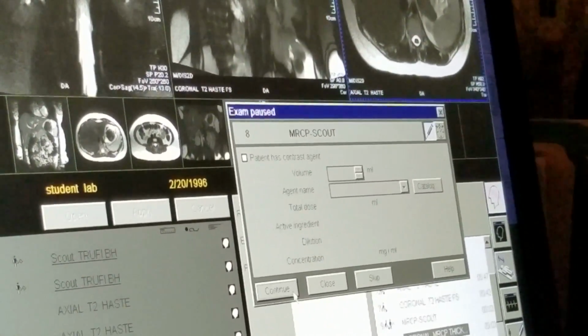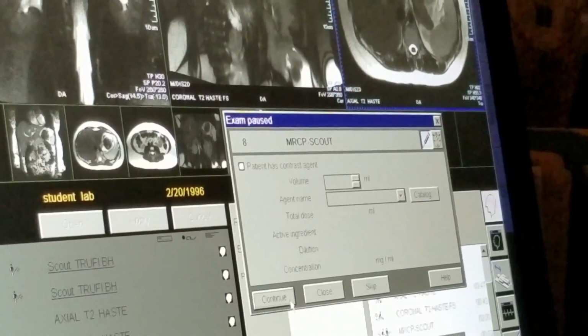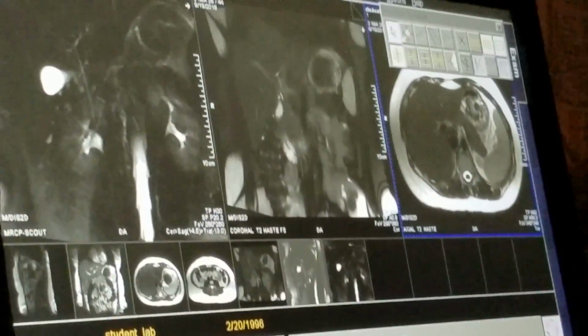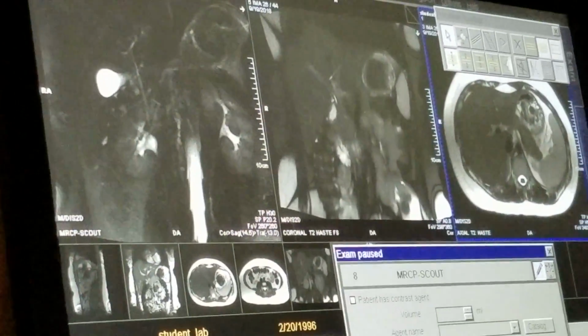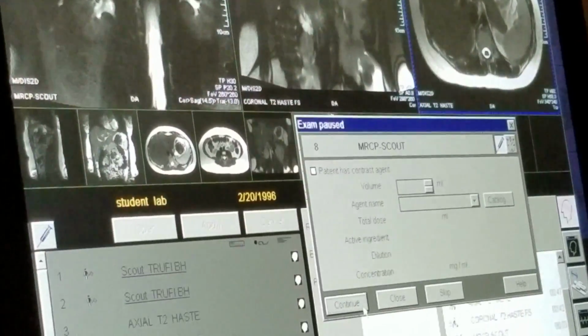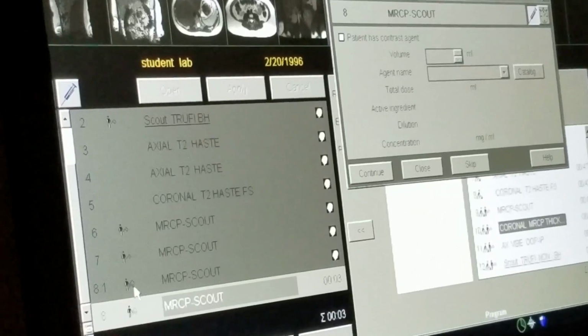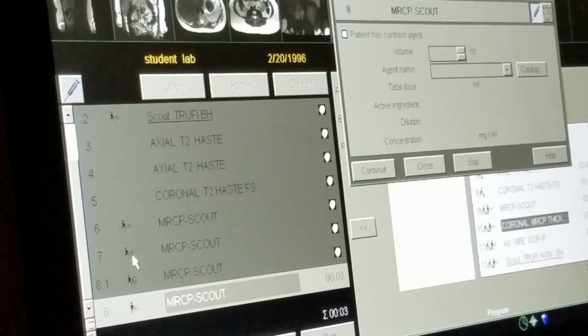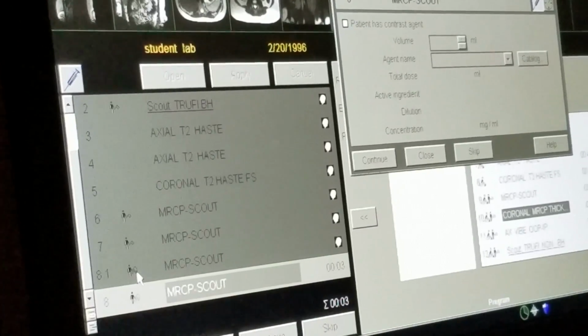Okay, Sarah, take a breath in. Hold it, please. Breathe. See how it popped up again for you? It'll keep doing that. If you look down here, prior to us putting repeated measurement on, it's only a flag man holding one flag. Now they're holding multiple flags.